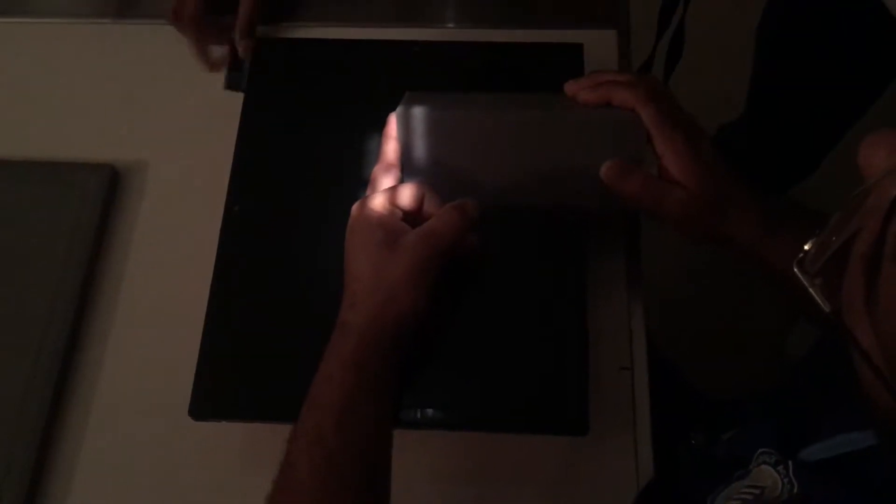Use this hand. I need you to extend that finger. Now I see where it is. I'm going to bring his hand up. Why are you doing lateral at the switch and at the middle? Oh yeah, third digit — my bad. Thank you, good observation.